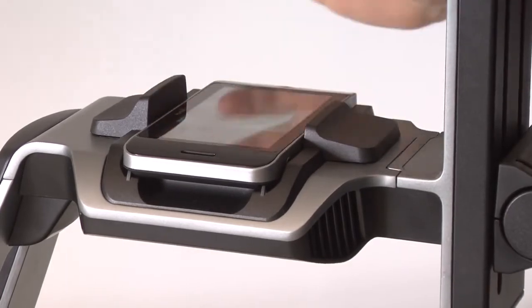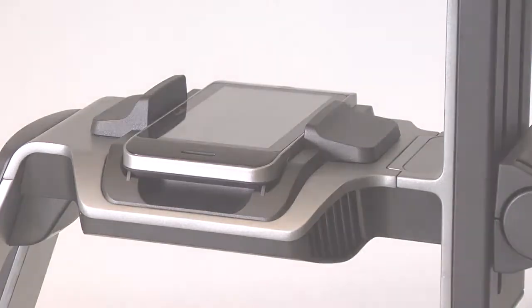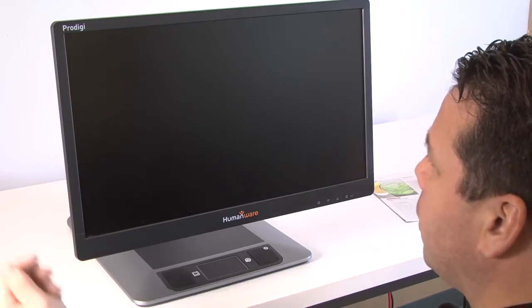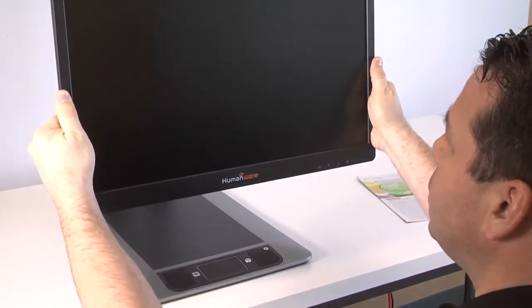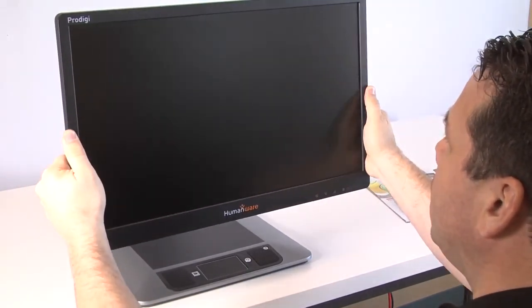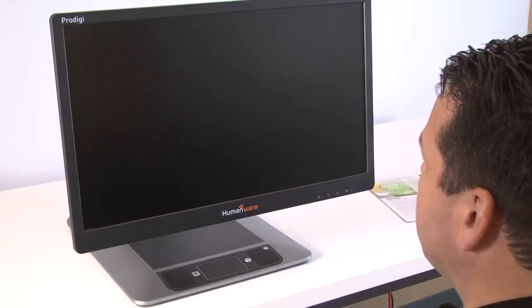To secure the tablet, once your Prodigy has been set on the table, the monitor is fully adjustable. Put your hands on each side and simply raise or lower the monitor. You can also change its angle and the tilt so that your eyes are right in the center of the screen.